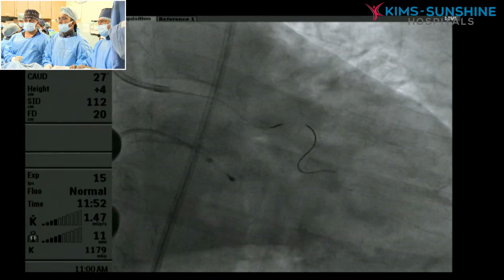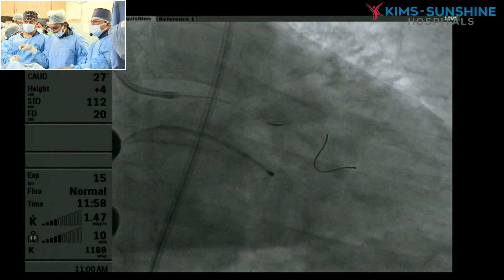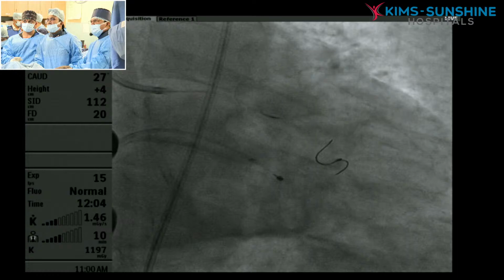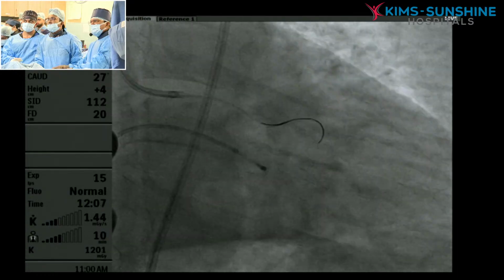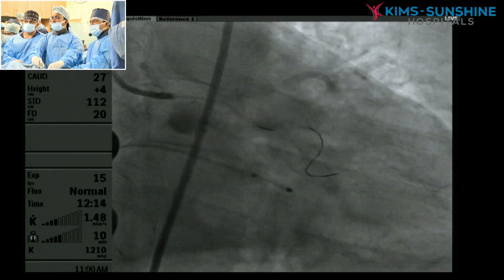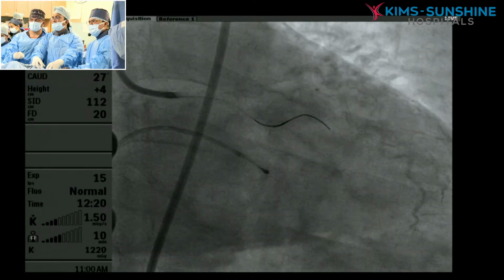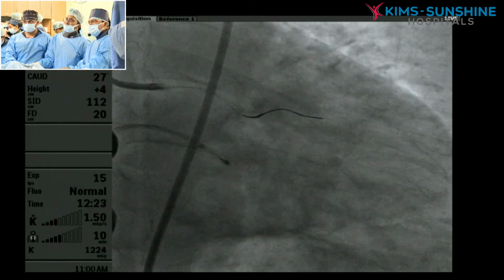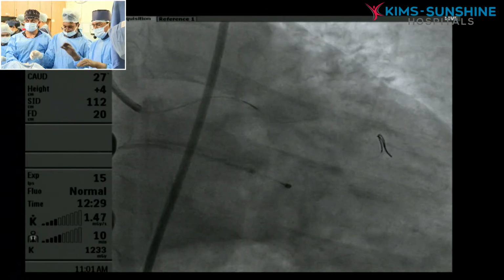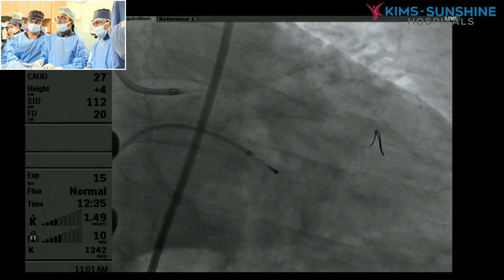Now try again. That's fine. It will go a little more, wait. I think it is right, but did the touch come on top? Now a small test. I think you are right. Hold it. Remove. No. I am holding. Remove the fine cross. Once you remove it, it will get engaged.